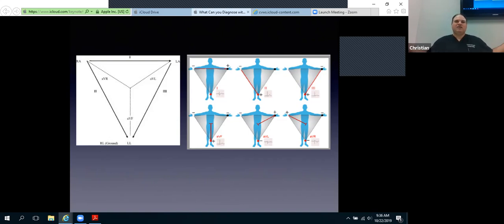So now, when you start to think about how the positive deflection in 2 is towards the left leg, right? The positive in lead 3 is towards the left leg. The positive in AVF is towards the left leg. And those represent the lower portion of the heart. So if you have an ST elevation in 2, 3, and AVF, that's an inferior infarct. Makes sense because you're looking at it from that perspective. And I often explain to patients that when we're looking at an EKG, it is like taking 12 snapshots of walking around a 4-bedroom house where you have 2 rooms upstairs and 2 rooms downstairs.